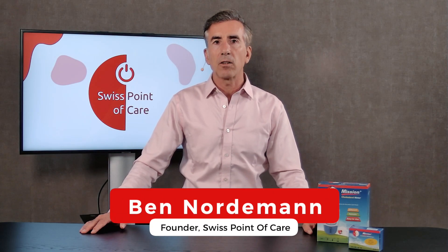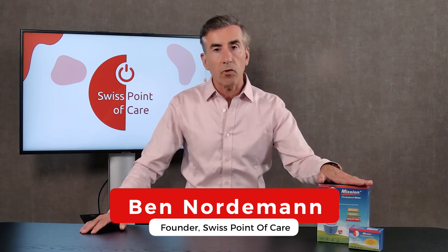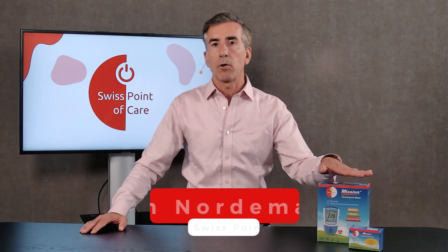Hello, I'm Ben Nordemann, founder of Swiss Point of Care. Today I'm going to show you the Mission 3-in-1 Cholesterol Meter. I'm going to show you what's inside the box, how to set it up, and how to use it.